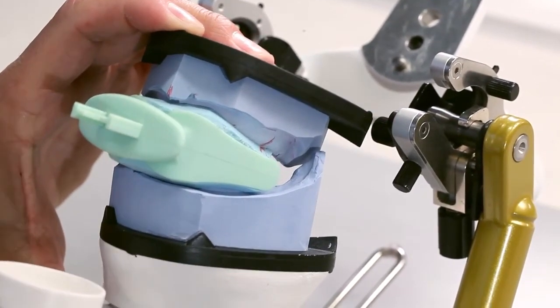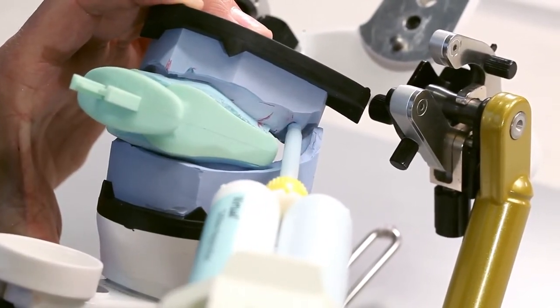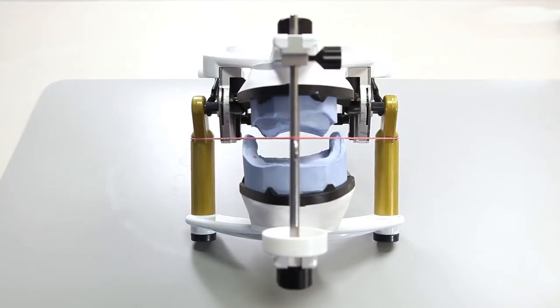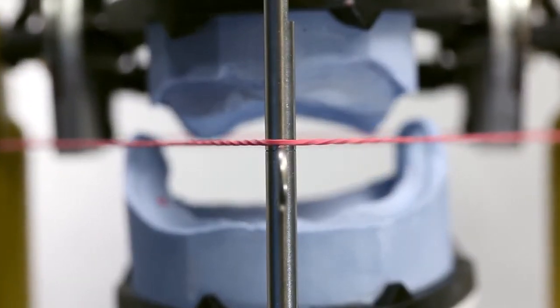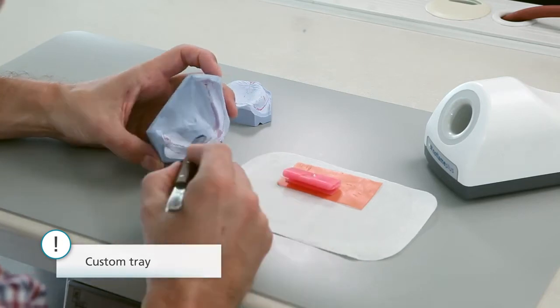Once the maxillary model has been secured with sticky wax or silicone, it can be articulated. If the models are extremely moist, use a fast-setting silicone. The models are already aligned as required, taking the temporary vertical dimension, the retromolar pad, as well as the anatomical midline into consideration. Carefully block out the undercuts with wax.